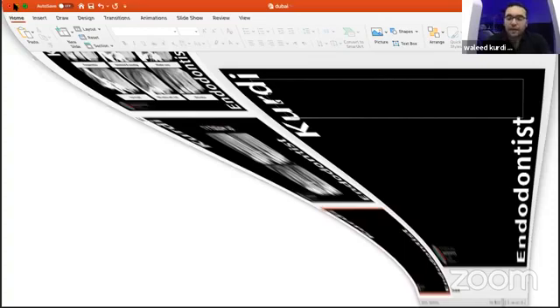Indeed, that's why I always say you have to use a smarter file to make the bypassing in the apical part. And indeed, not all the cases can you bypass the broken file successfully. We are just here to share a protocol, to have a feasible, repeatable, teachable protocol, so you will have a higher success rate if you are using it. But not all the cases indeed. But at least if you are using this protocol, you will have at least 8 or 9 cases from 10. And I think this is a fine way.